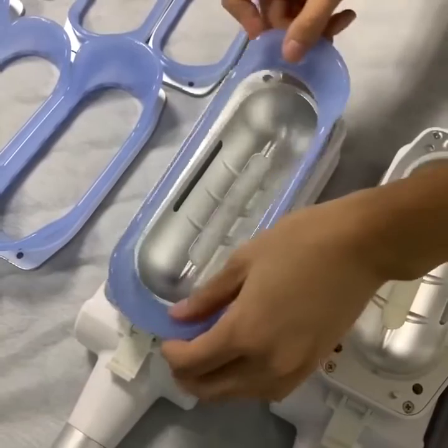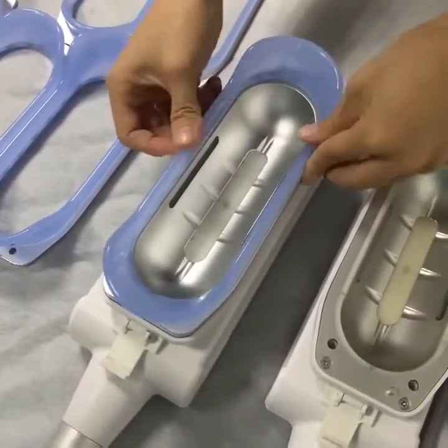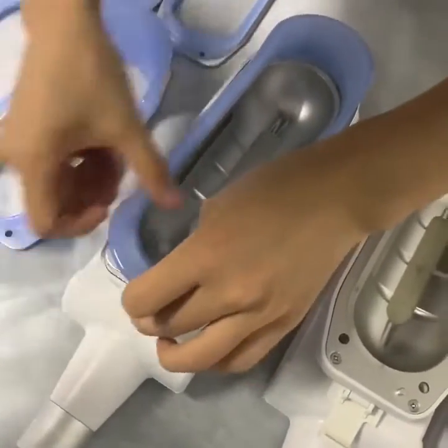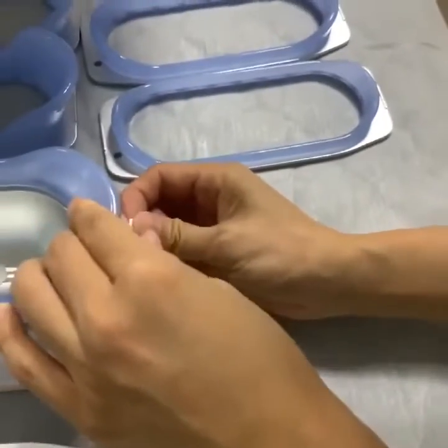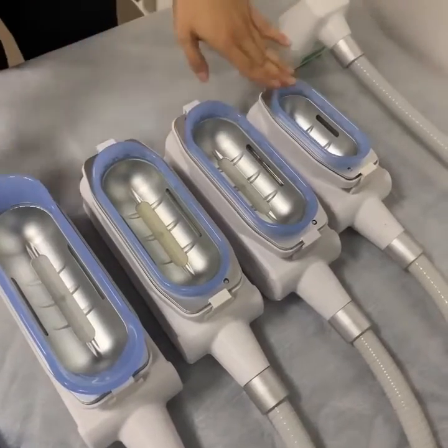...we will put this handle cap on the working handle, like this. Match the position. And the last step, we will use this part and then tie it. The same operation applies to all the others.